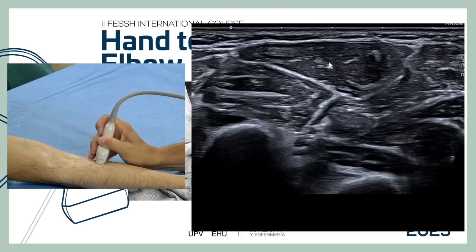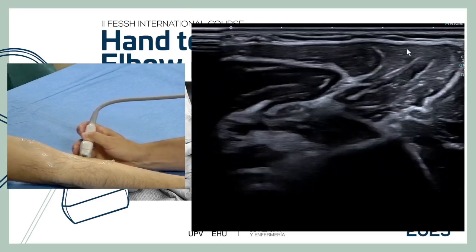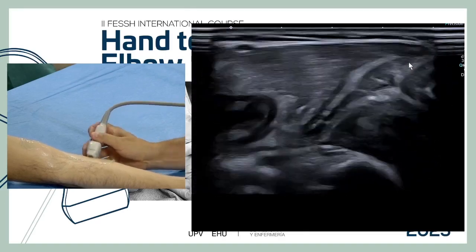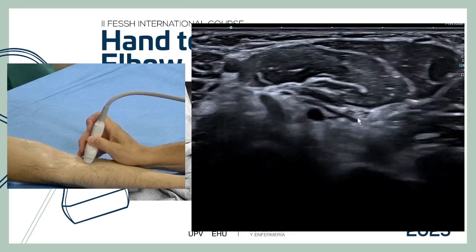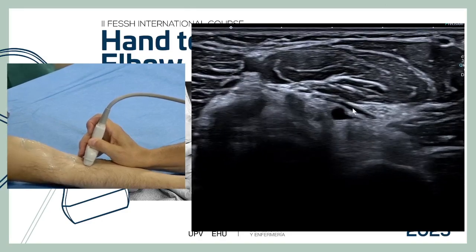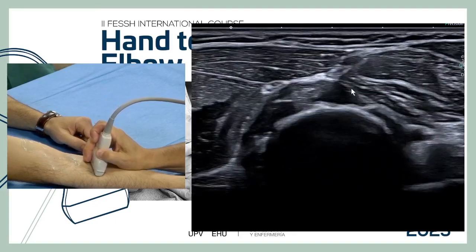After the pronator teres, the next muscle is the flexor carpi radialis. This patient has no palmaris longus, as we can see. The next is the flexor digitorum superficialis, and the last is the flexor carpi ulnaris. The second head of the pronator is between the artery and the median nerve — very thin in this case. Moving to radial we see the ulnar head of the pronator, and the median nerve passes between the two heads.